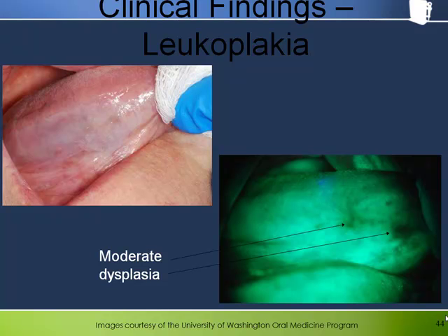Yet another example of the Velscope showing loss of fluorescence that makes an area of suspicion more visible than in white light. The combination of both visualization methods significantly enhances the diagnostic data for decision-making. The dark areas in the anterior region of changes on the scope were vague in the clinical view but were found to contain moderate dysplasia.